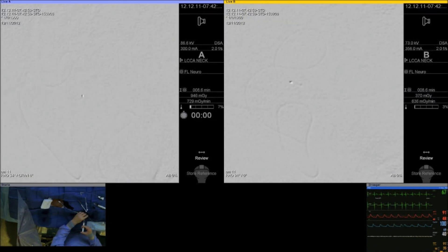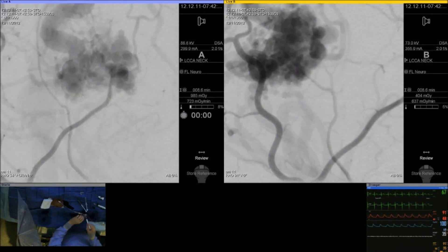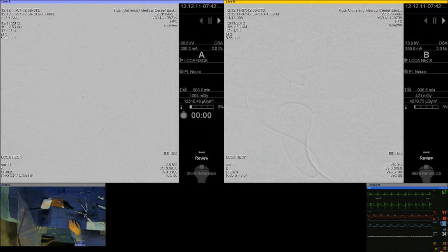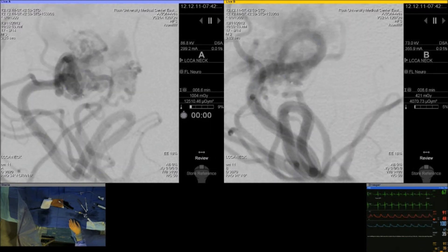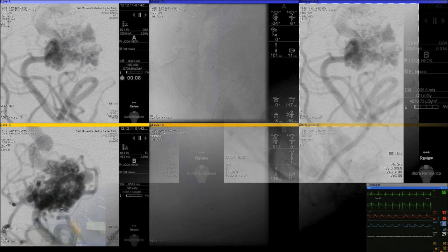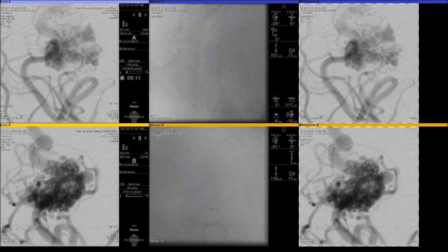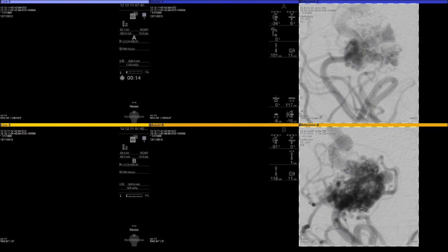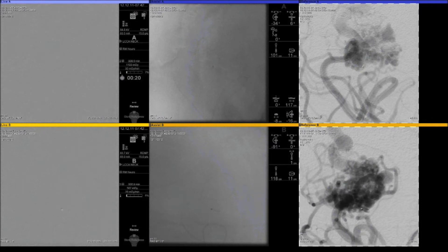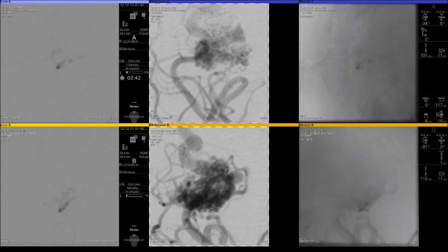Here you see the position of the microcatheter in relation to the AVM nidus. A microcatheter injection is quite important. The setup, as you can see in the lower left corner, is simple — only a six-French guide with a Marathon microcatheter into the AVM. I don't use heparinization during these cases, mainly to avoid potential subarachnoid hemorrhage when you remove the microcatheter at the end of the procedure with an Onyx cast, at least until detachable catheters become available.